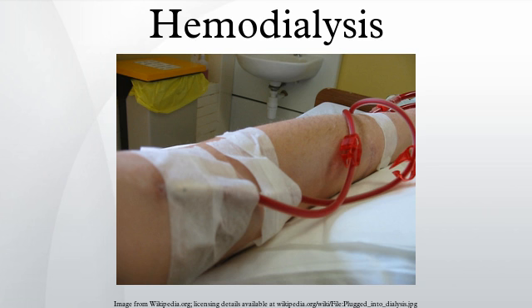Nursing care for hemodialysis patients. Adapted from Nephrology Nursing Practice Recommendations developed by the Canadian Association of Nephrology Nurses and Technologists, based on best available evidence and clinical practice guidelines. Hemodialysis vascular access: a nephrology nurse should assess the fistula, graft and arm before and after each dialysis or every shift, the access flow, and complications.